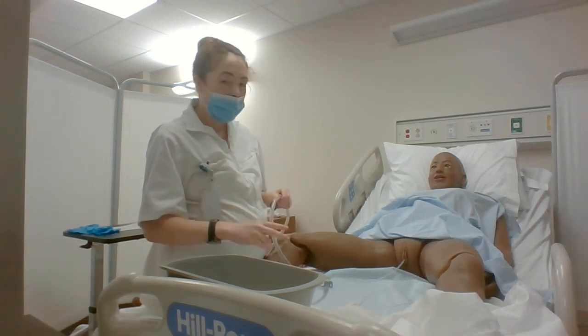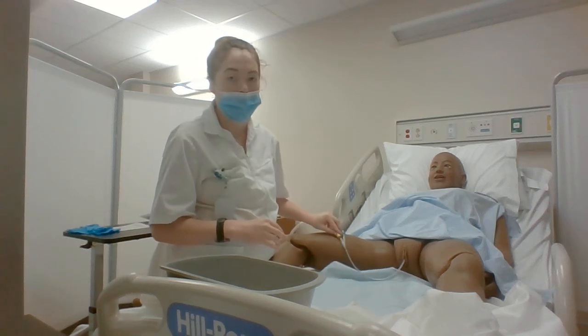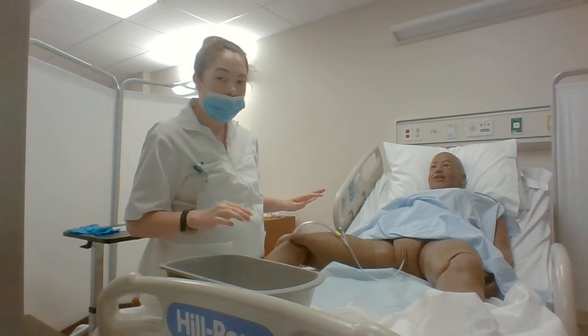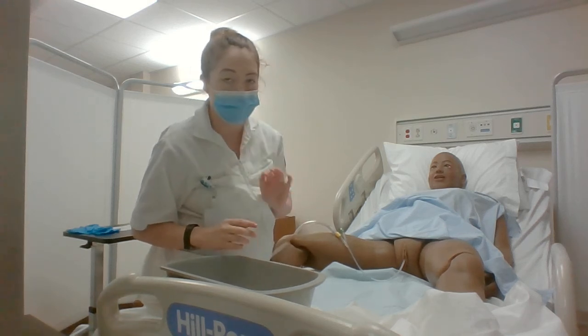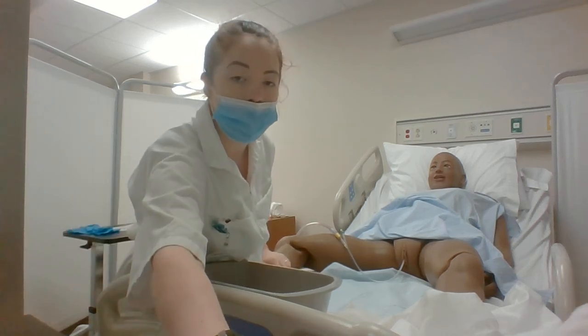And reattach the catheter to the upper thigh, or for a male to the lower abdomen, and then empty the catheter bag if necessary, and replace it.